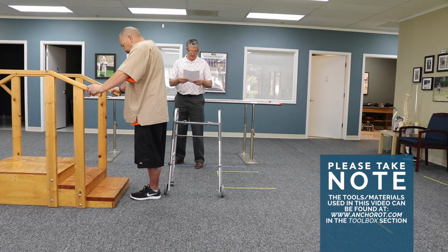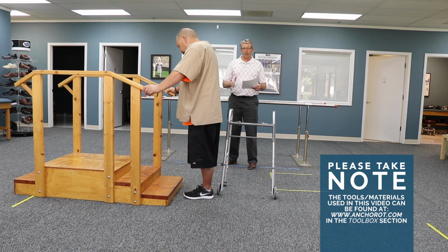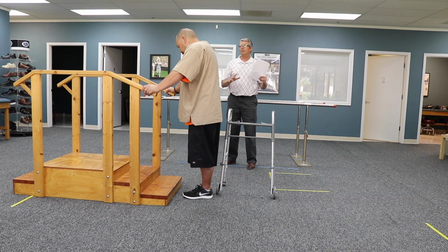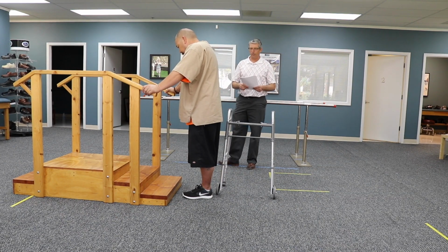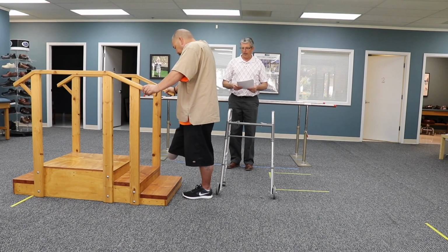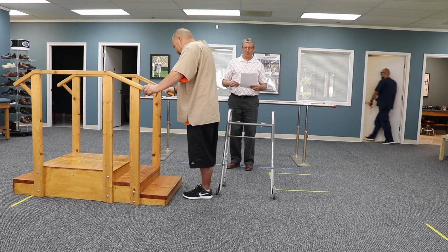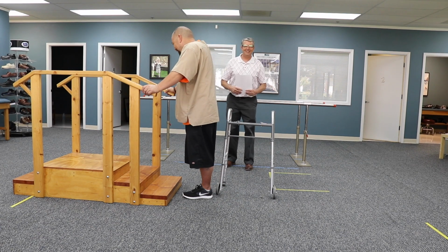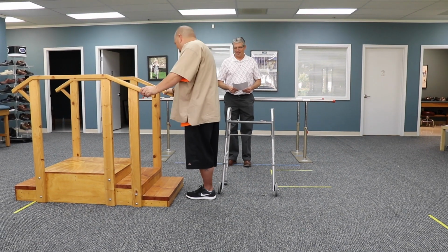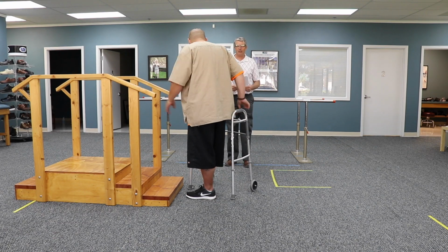Okay. Again, if your patient is uncomfortable doing this, you don't have the strength or balance, don't do it. It's a very advanced move. And even if I've had patients say they can do it without the railings, no, you can't. I'm not going to have you break an ankle on my watch. So don't do it. Okay? So that's stairs. You want your patient to be able to go up and down.